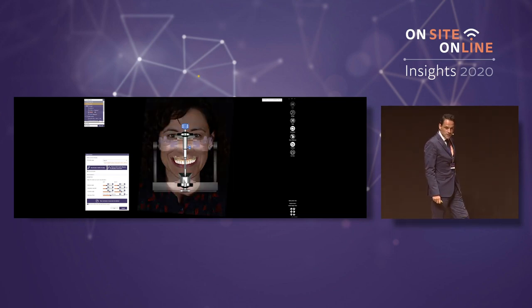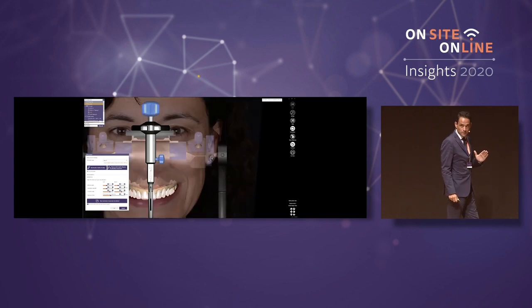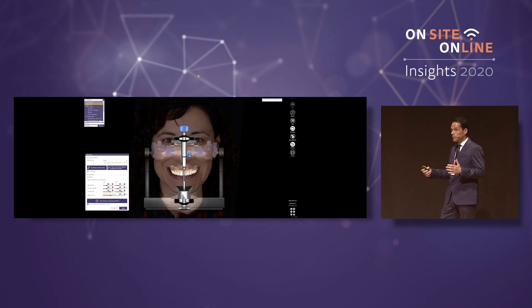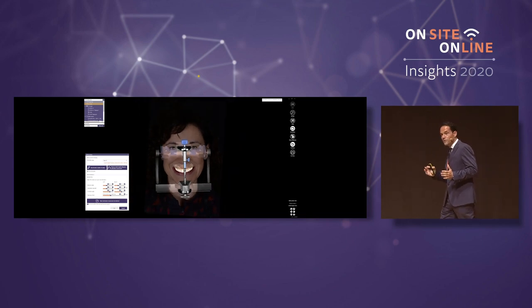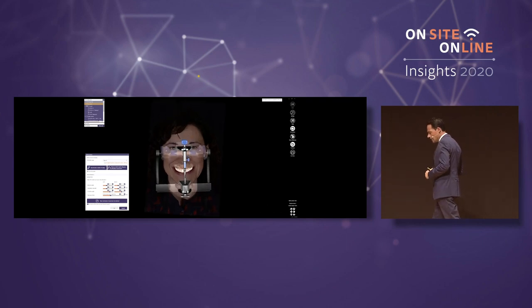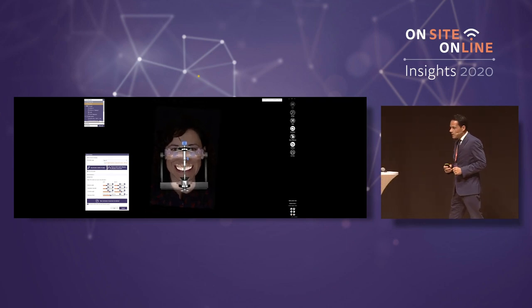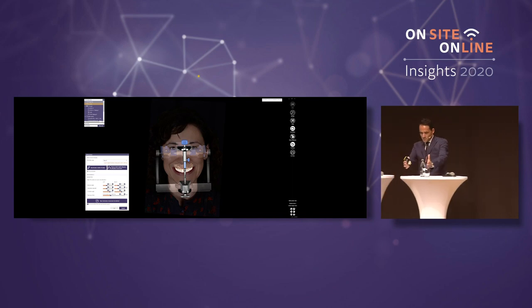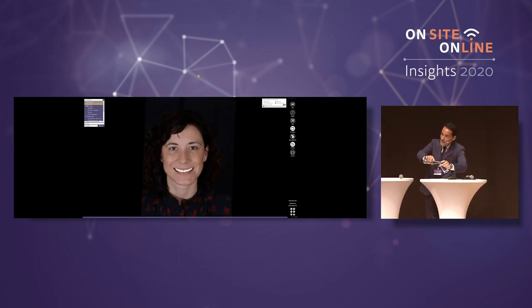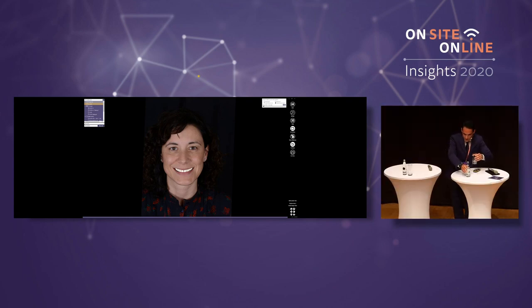We don't lose the position of the models in the articulator. It is very important. Now I have two positions, or three, or more. One of them is for aesthetics, and another one is going to be for occlusion. So if I trust the position of my models in the articulator for aesthetics, I lose. But now I have the possibility to value it aligned with the photography.